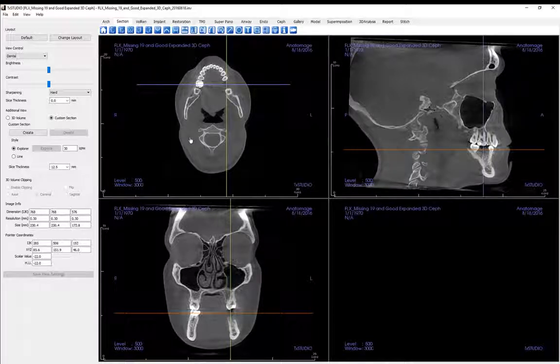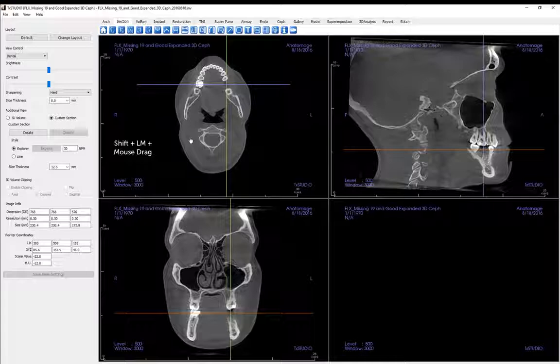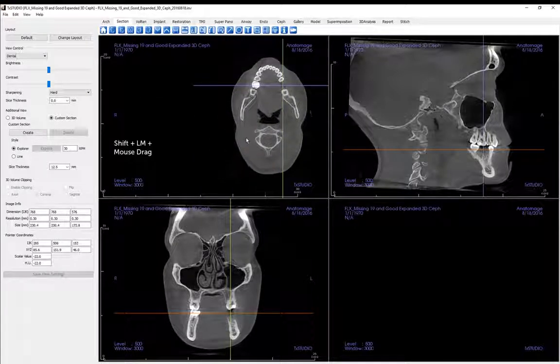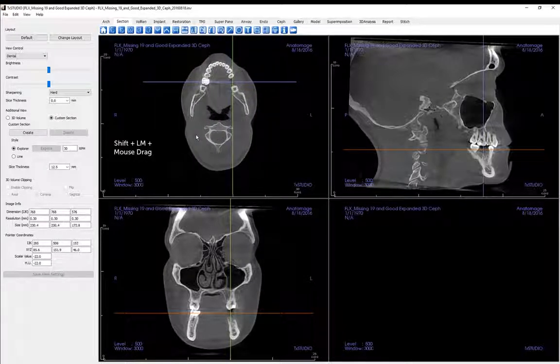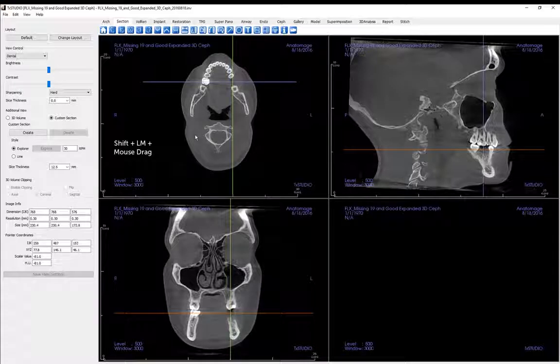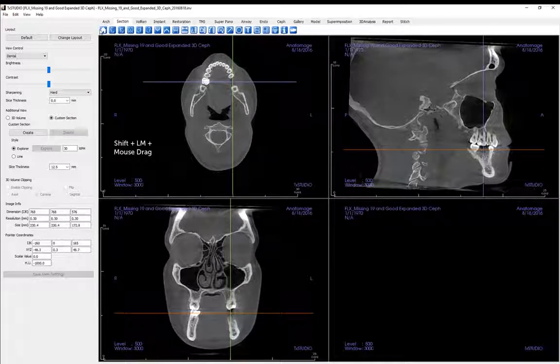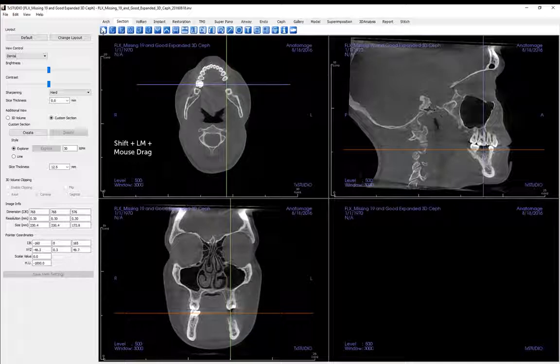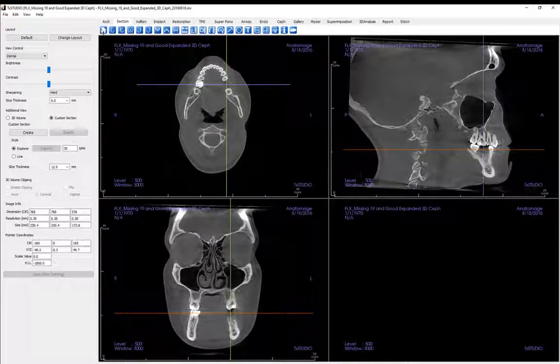You may want to move the image on the screen or pan the image. To do so, move your mouse cursor to an image, depress the Shift keyboard key and the left mouse button and move your mouse. As with the zoom feature, you may click the toolbar's reset view to revert to the default position.